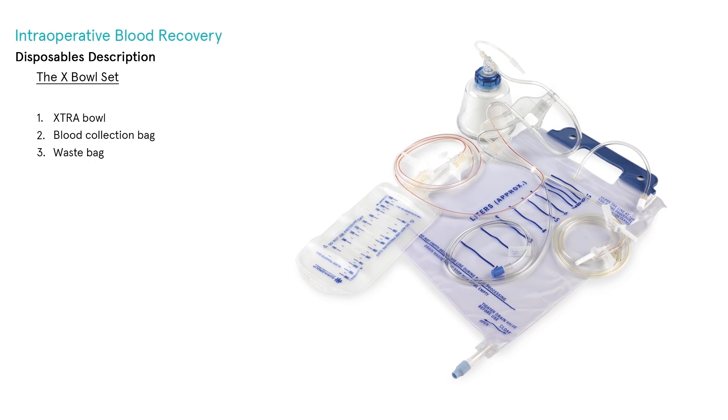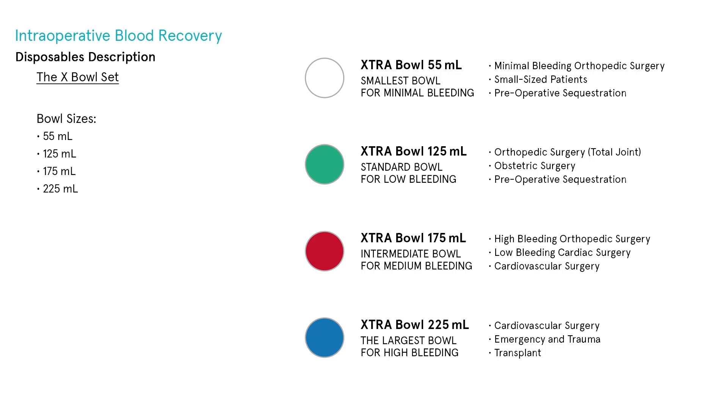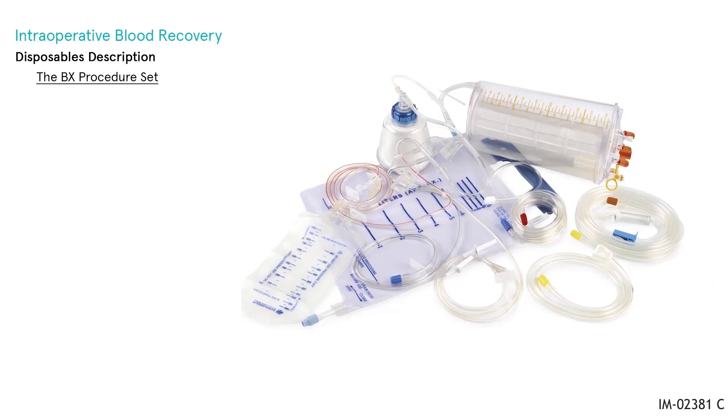The X-Bowl set provides the extra bowl and related items to process the blood recovered from the intraoperative field and postoperative drains. It contains the extra bowl with pre-connected color-coded tubing and cartridge, a pre-connected blood collection bag, and a waste bag. It allows the clinician to choose the most appropriate bowl size — 55 mL, 125 mL, 175 mL, or 225 mL — based on blood loss. A chart summarizes the primary situations and surgical specialties where each bowl size is preferred.